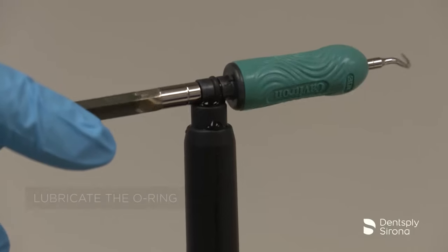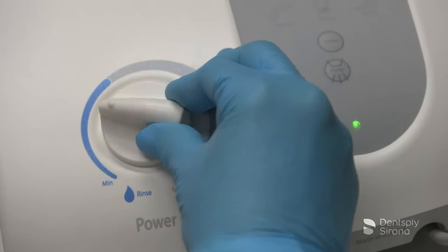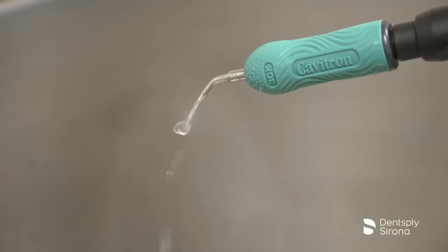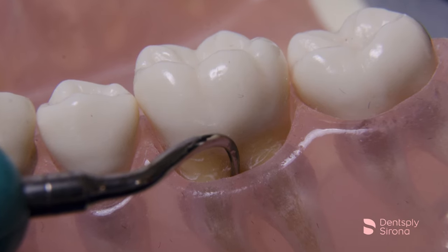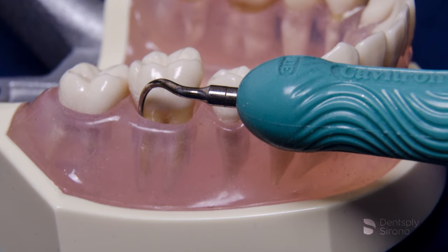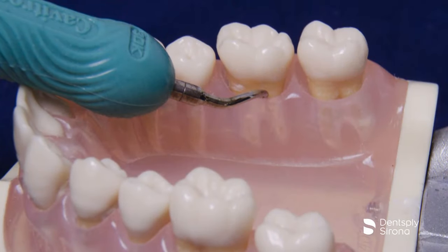After the clinician has filled the handpiece with water, seated the insert, selected the power, and adjusted the spray properly, instrumentation begins according to the treatment plan. When access is indicated in deeper pockets, in particular the posterior teeth, the curved insert is often necessary to maintain true adaptation of the terminal 2 to 3 millimeters at all times.